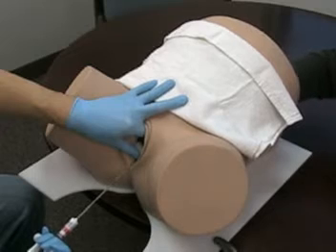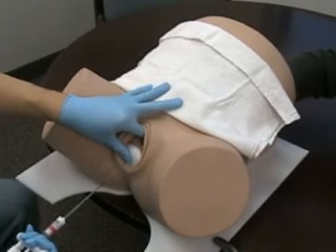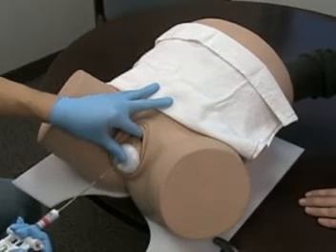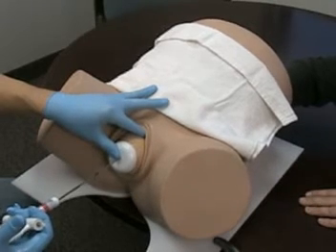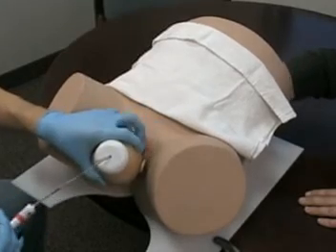As the head begins to emerge, the traction is slowly initiated upwards until the head begins to crown, and eventually the head is delivered.